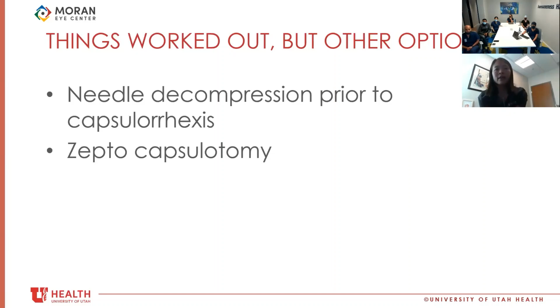Yeah, and I think having two radial tears may have been a bit of a godsend, because if there was only one, I think all the energy would have gone into that one, and it would have had a higher chance of propagating around to the posterior capsule. But because there were two, it was almost like a mini can opener technique, the old can opener technique, making lots of little radial tears to relax. The two took the pressure off a single radial tear. So I think that actually helped.